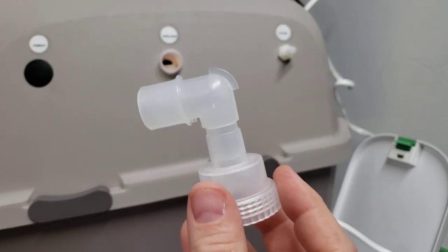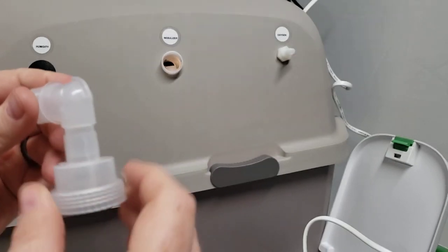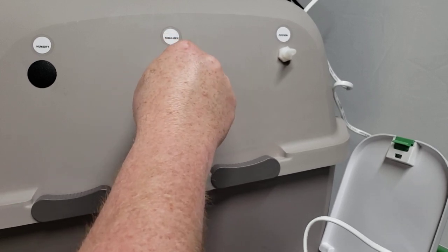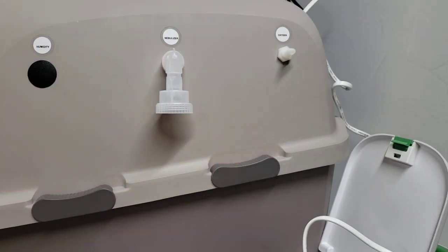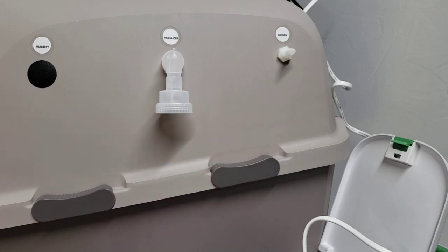That's going to leave you with just the top piece and the elbow. Go ahead and push that — hold it from the inside — and then push that tightly into the fitting there so that it provides access for the contents of your cup. That's going to provide access into the incubator. The next thing I'm going to focus on is going ahead and hooking that up to your nebulizer pump.